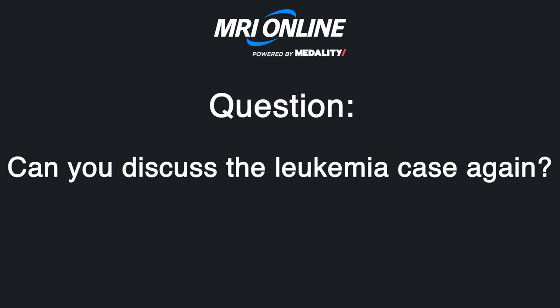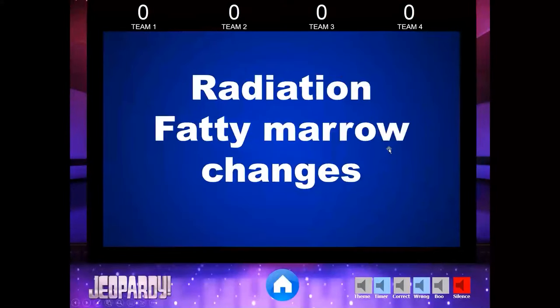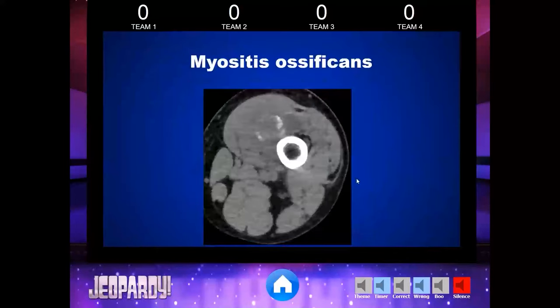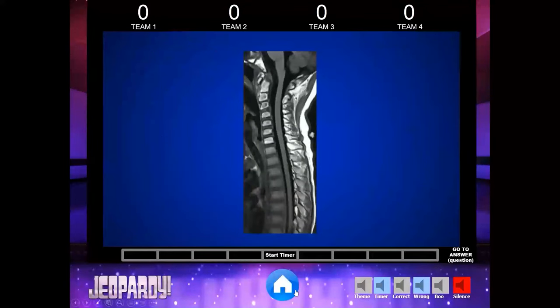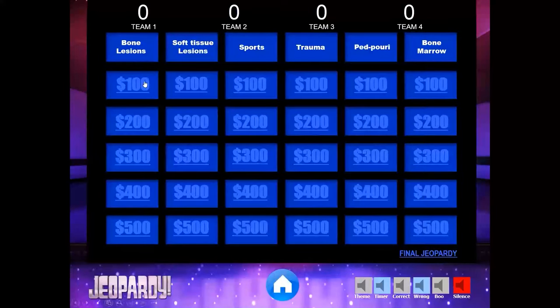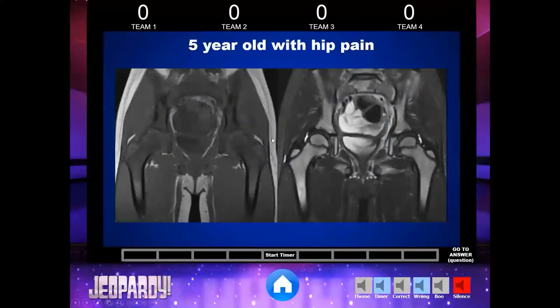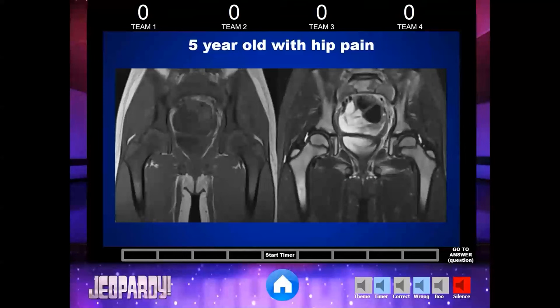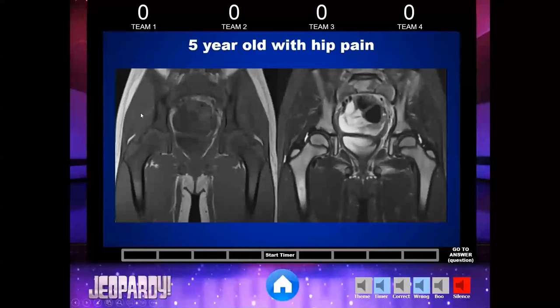Going back to the leukemia case. When you first look at the marrow, symmetry is not going to help you as much in these cases — it's very tricky. You want to get used to what normal marrow looks like. On a STIR image, the marrow should be kind of grayish. You would never have marrow this bright — that should be alarming. On T1, notice that the marrow is darker than adjacent skeletal muscle. That is concerning for a malignant process.